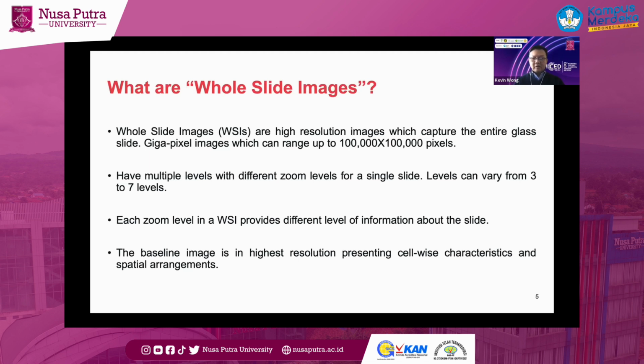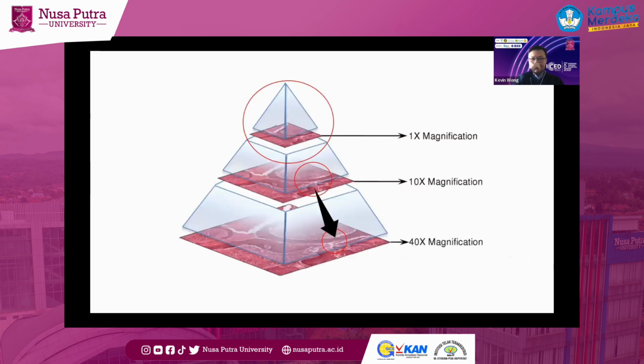Just like when you look into the microscope, if you want to know more about that area and you want to diagnose whether there's a blood vessel, whether the cancer cell is true or not, you will have to zoom in. So this gives you an illustration of the magnification. You can go from 1 times all the way to 40 times.